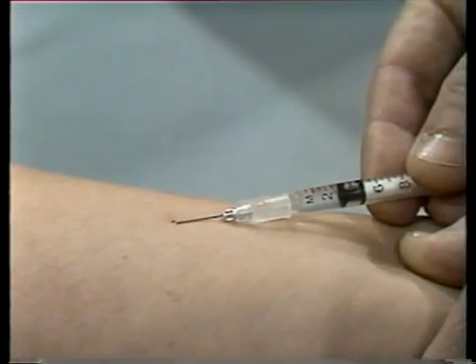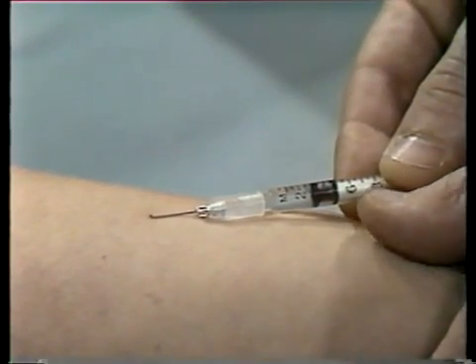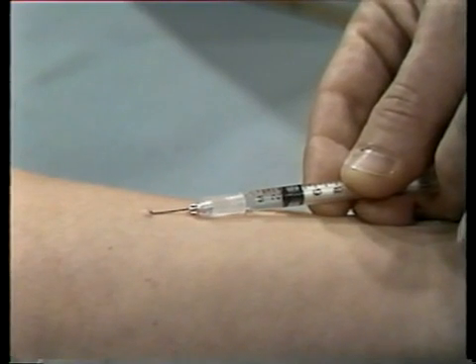Insert the needle only enough so that the cutting edge or bevel penetrates the skin. When the needle has penetrated the skin, you can use your other hand to operate the plunger.